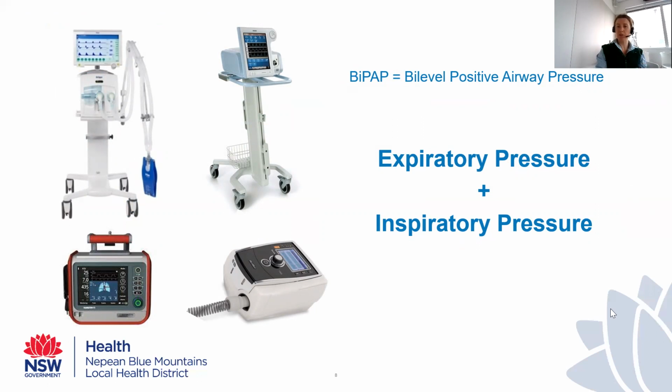We have two pressures. So CPAP is the one level. So that's always got an expiratory pressure. Bi-level has an expiratory pressure, and now we're adding in an inspiratory pressure. On most machines that you can do CPAP on, you can also do BiPAP on. So the machinery is much the same. There may be a couple out there on the market that only do CPAP, but they're usually quite unusual in an acute setting. Most of our machines that we would have access to do both.